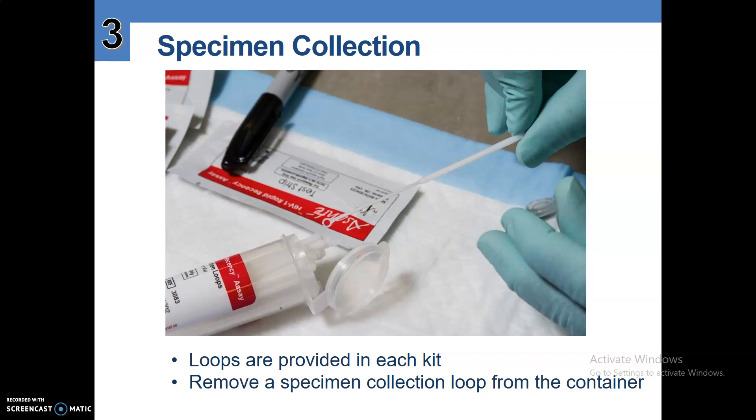Number three, specimen collection. Loops are provided in each kit. Remove a specimen collection loop from the container.